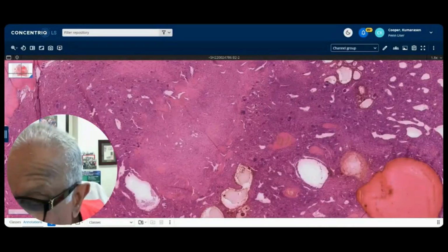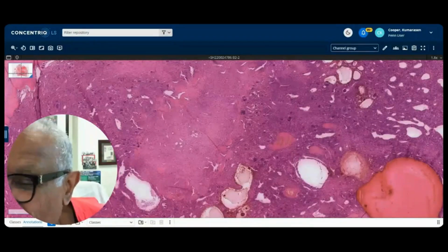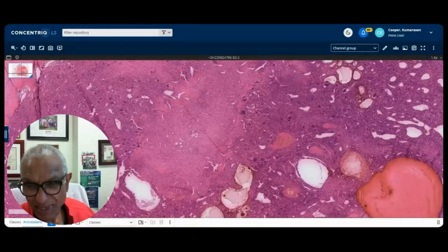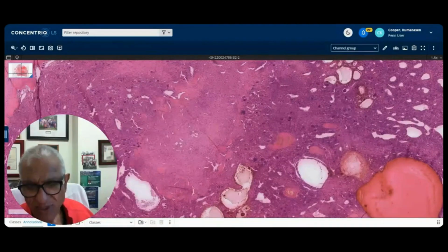Woven bone, yeah, that's correct. It came up as "woman bone fragment." So yeah, I would probably say that the major hint is spindled instead of epithelioid. True, but you can get more epithelioid cells as well in ABCs. There's no real clue. I think it's going through your differential diagnosis and keeping in mind ABCs can be solid, and in this context, thinking about it, and we fortunately have USP6 FISH, and that is positive.